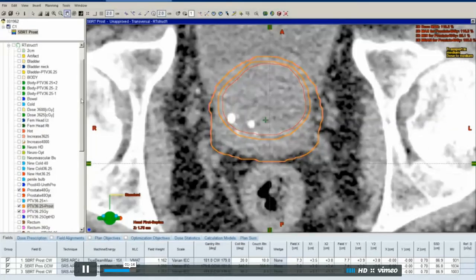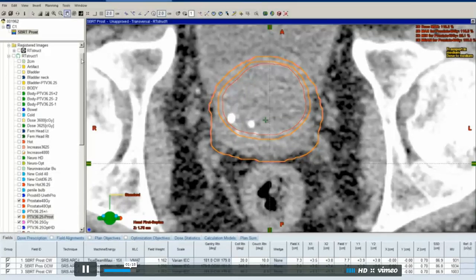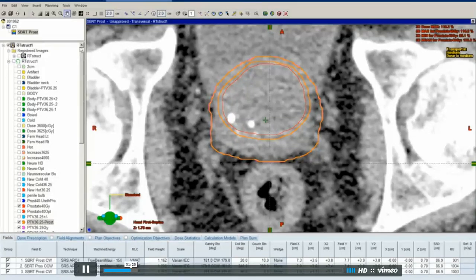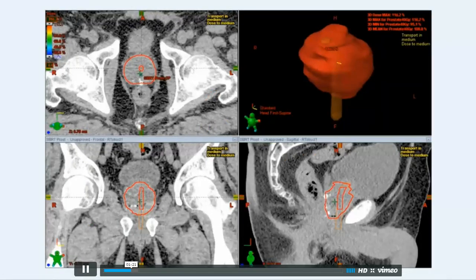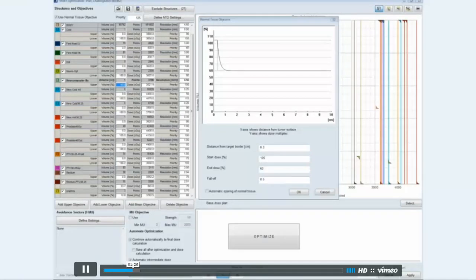Did you use the NTO at all during this? Yes, I used the NTO. I used the automatic NTO at first, and I noticed that the PTV36 was underdosed at the edges.